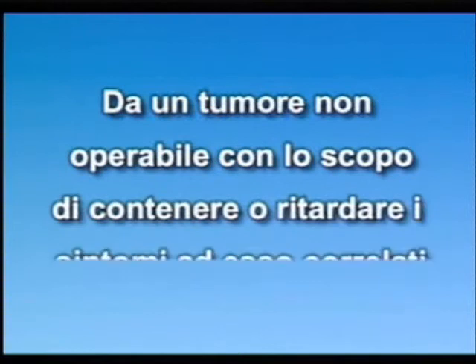The target volume may include the surgical bed or the areas believed to be more at risk of recurrence after complete resection of the tumor, or the residual tumor, which cannot be technically excised, or even an unresectable tumor to control or delay its symptoms.